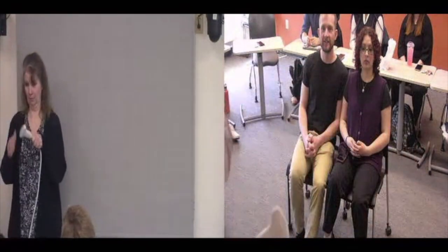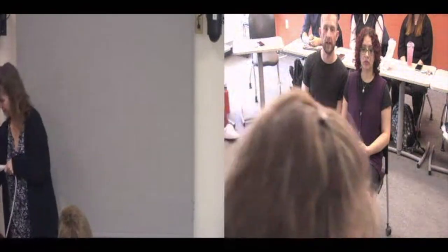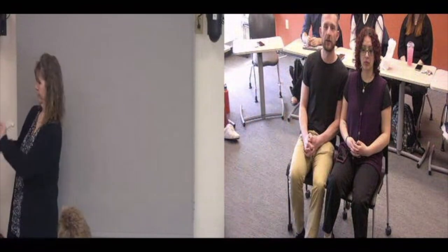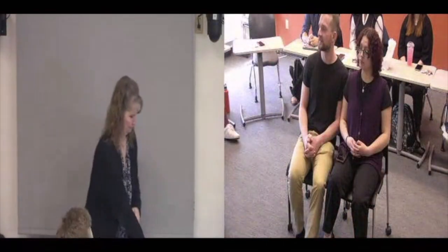So really, let me show you right here. This device emits wavelengths into the body and they bounce back, where it is then interpreted into results that you can view on the screen. It's an amazing process. Have you all seen this before? Yeah, so this is critical to know. This is the foundation of medical healthcare.